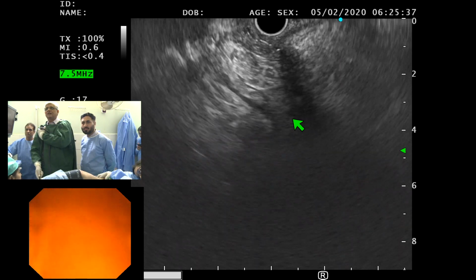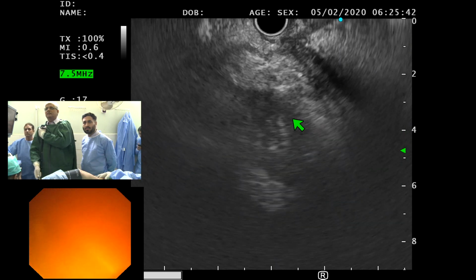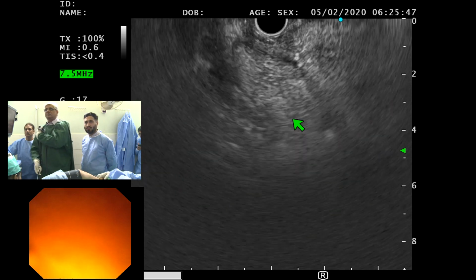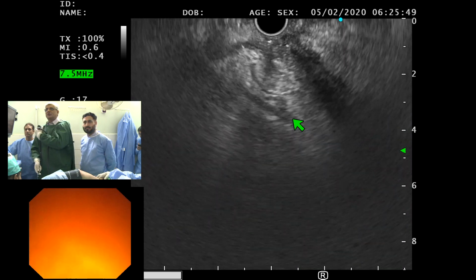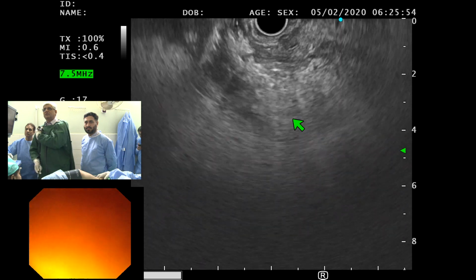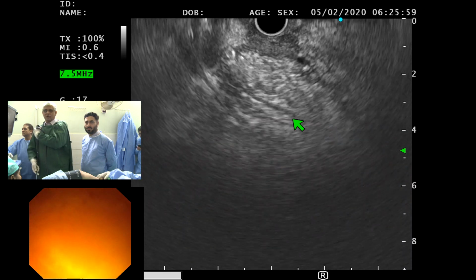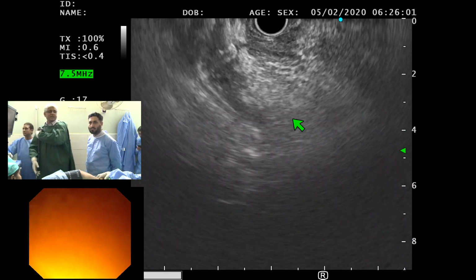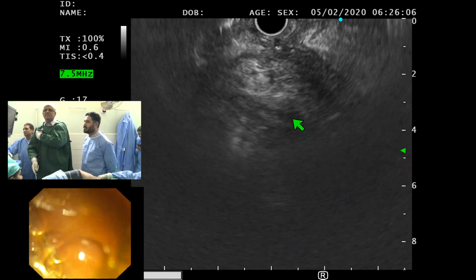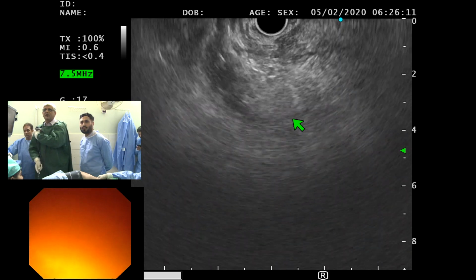So we've got the stent, so I let go of my big wheel a little bit and we can see the stent here. So we'll try and see if we can bring it a little bit more straight. And what I'm doing here is basically just torque left and right. Nothing else than a very slight movement to see if I can get things where I want.